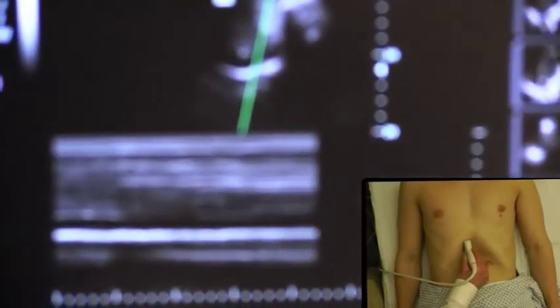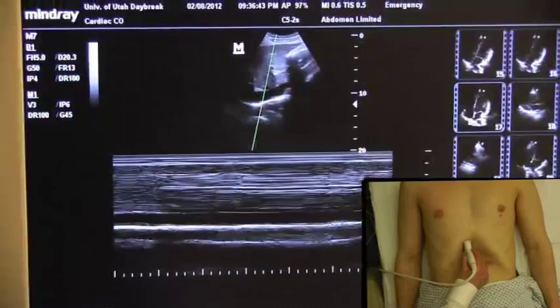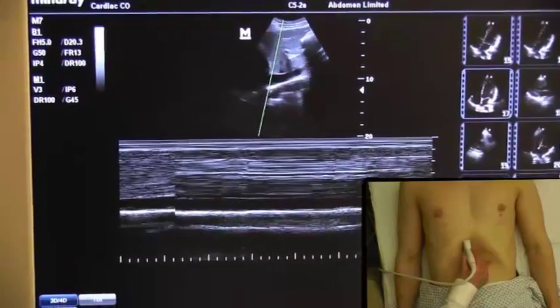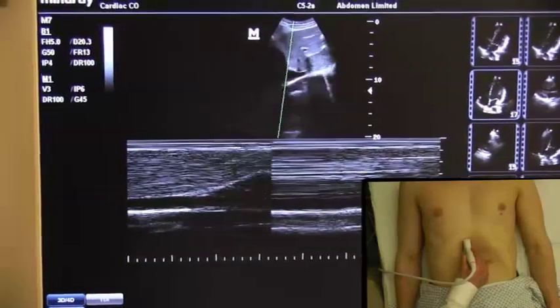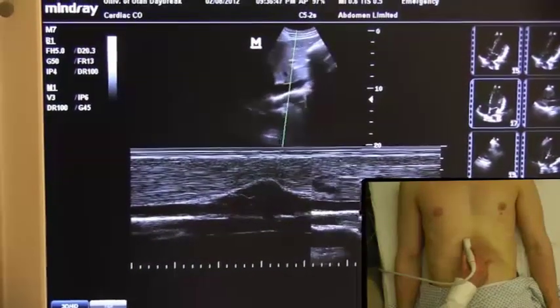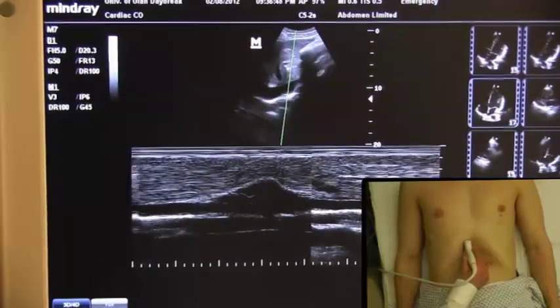Using M-mode, I'll place the ice pick through the proximal IVC 2-3 cm from the heart border, or just distal to the first hepatic vein.